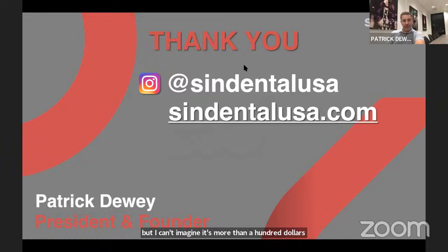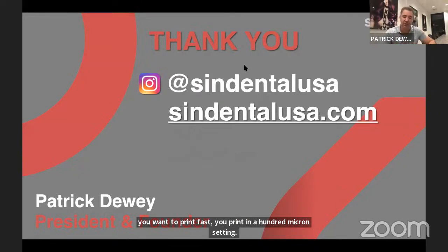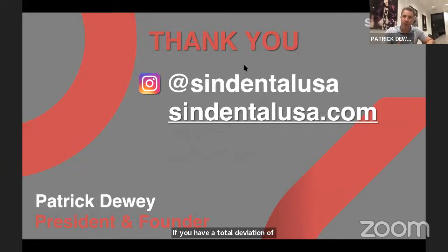So, Dr. Liu, you asked, is that build plate only for Sprintray 55S, not 95S? It's a great question. I'm glad you asked this. Ryan mentioned it's only for the 55S. They do actually have one for the 95. However, it's very important to understand that the 95 is a 90 micron accuracy printer. And on top of it, the setting that we print in, because you want to print fast, is the 100 micron setting. If you have a total deviation of 90 plus 100, you're already at 190 microns of accuracy.